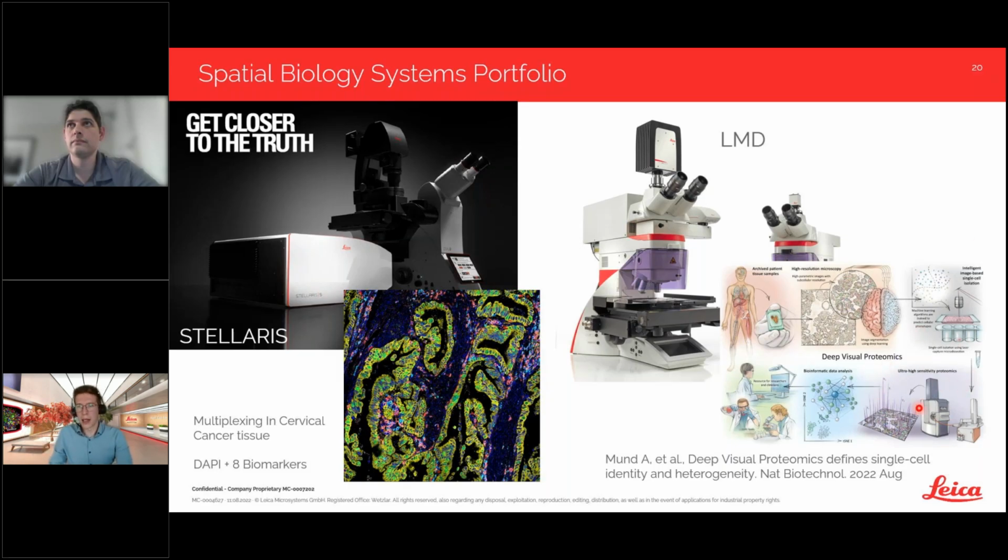And then you can take these cells and really on a single cell level do, for example, mass spec on those cells to get a protein profile. And this then really allows you to connect our spatial biology workflow that I've shown you some examples of here with mass spec analysis, which is something that will be very useful for things like personalized medicine, for instance, in the future.